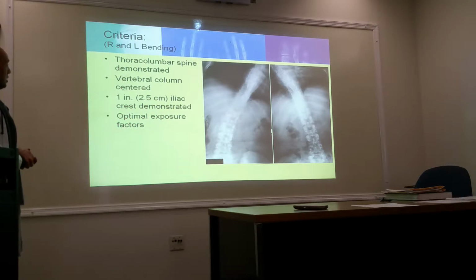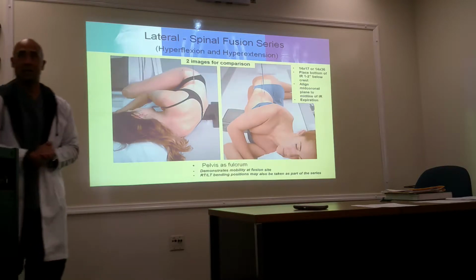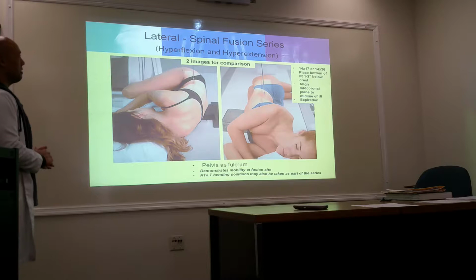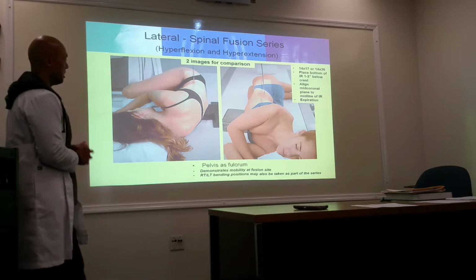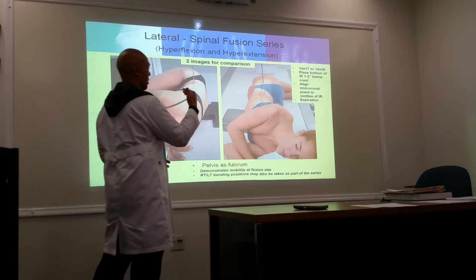It is to demonstrate motion. Okay, questions here? Let's keep on going. Okay, lateral hyperflexion and hyperextension. This is also done with two images, comparing the two. Same criteria of positioning your image receptor.